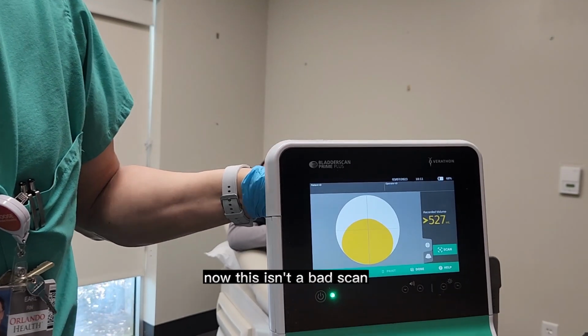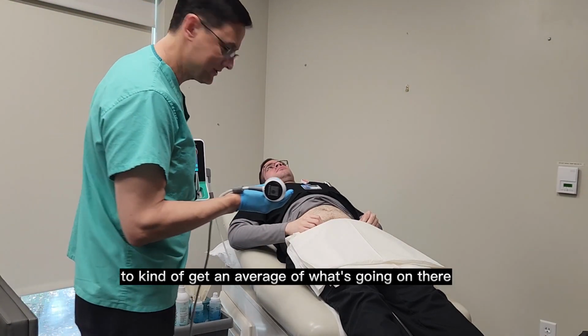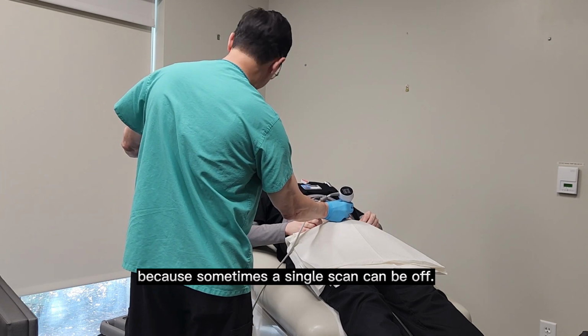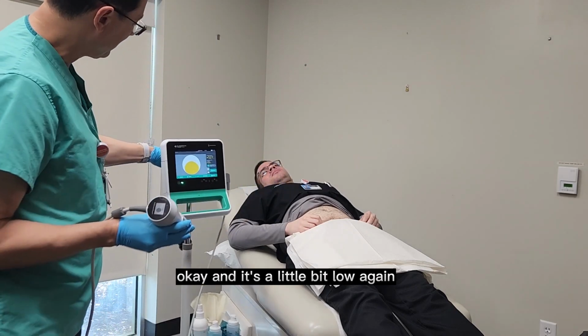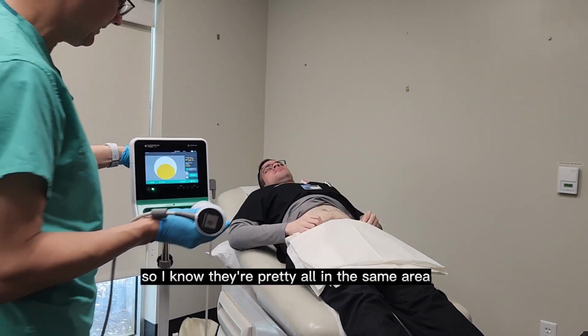Now this isn't a bad scan, but usually I like to scan them several times to get an average of what's going on there, because sometimes a single scan can be off. So I'm going to scan them again. I'm going to get it centered. Okay, and it's a little bit low again, but about 525, so I know they're all in the same area.